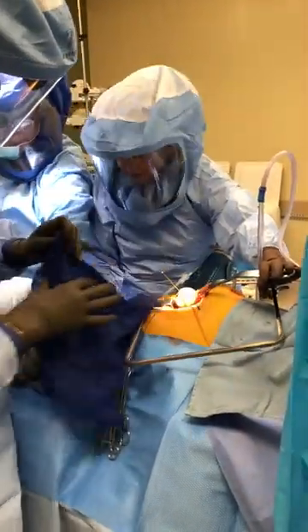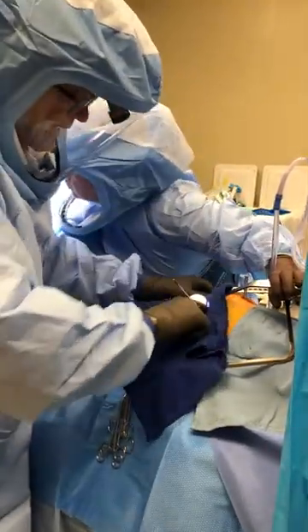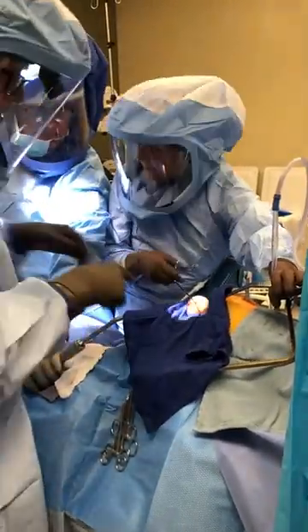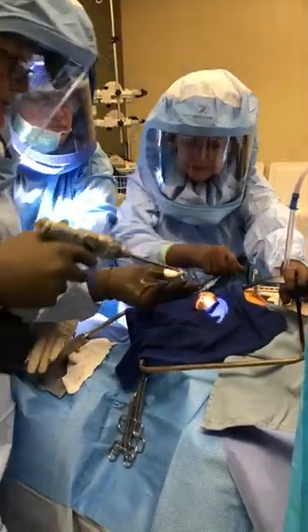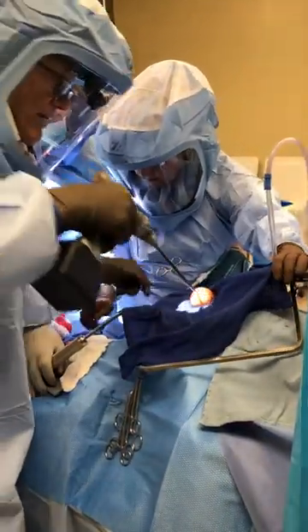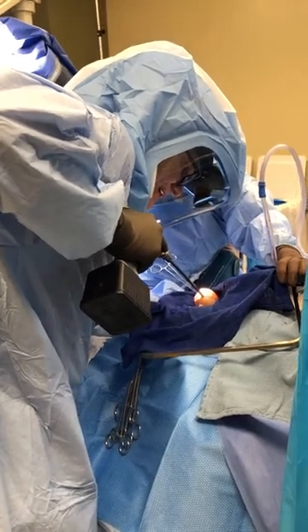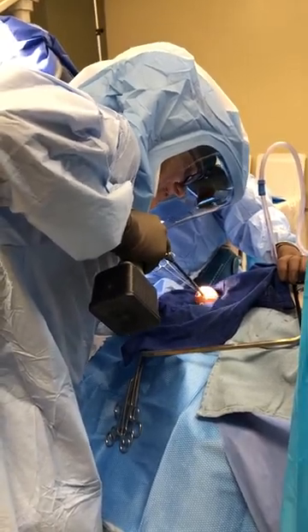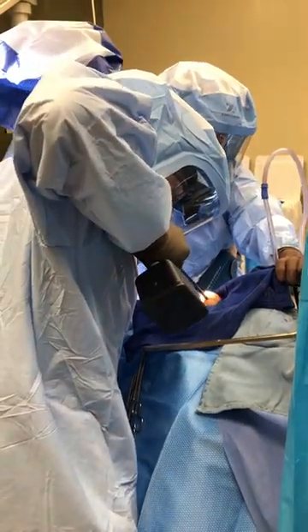So now we've got the pin driven through the lateral cortex to anchor it so it won't wobble and get thrown off. We'll throw a little slotted towel around it to catch the debris. This is an 8-millimeter cannulated reamer, and it's got markings about how deep you should go in. It's not that important — just that you go deep enough. Over-shooting is not a problem; you can never go out the lateral side. I'm going to lean into it a little bit because you've got hard bones.